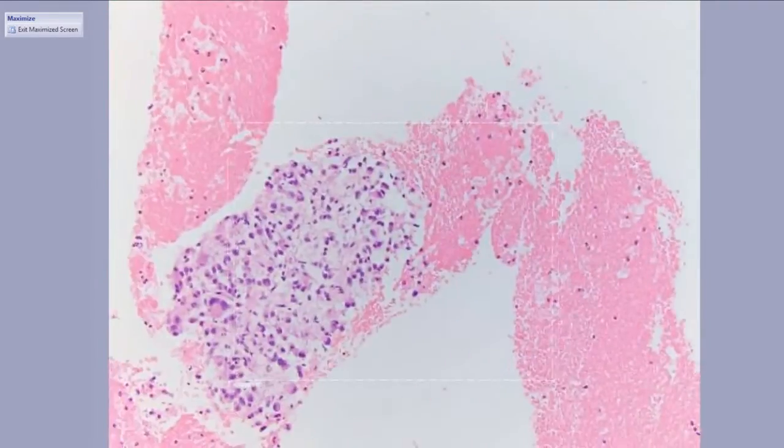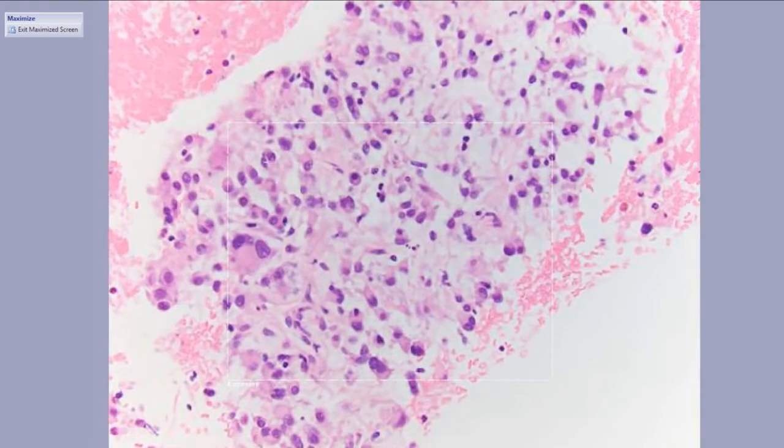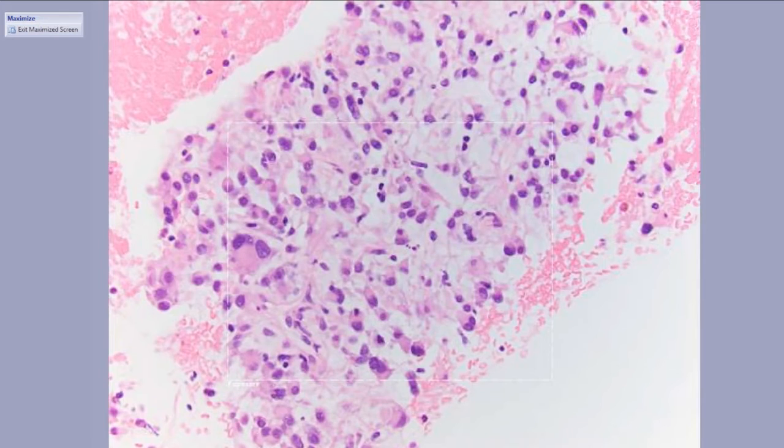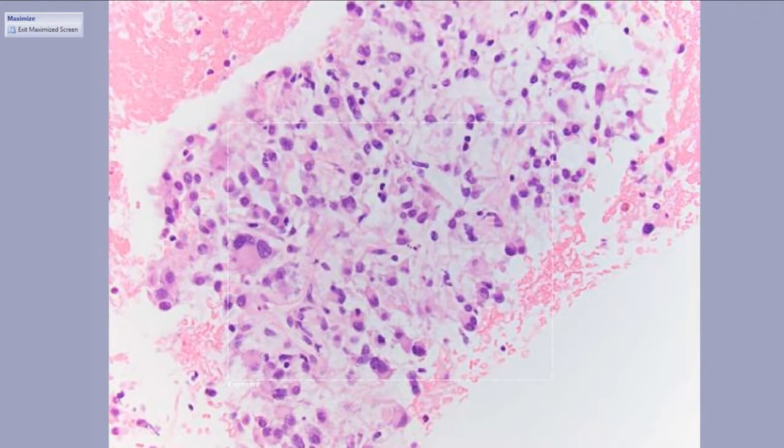Here you can see, I think it's maybe best right here. So there's a wide differential diagnosis for this. When I got this, I threw about 10 immunostains on it. But if you've been paying attention, you might be able to guess that this was also positive for c-kit and DOG1, making this yet another GIST of the stomach.